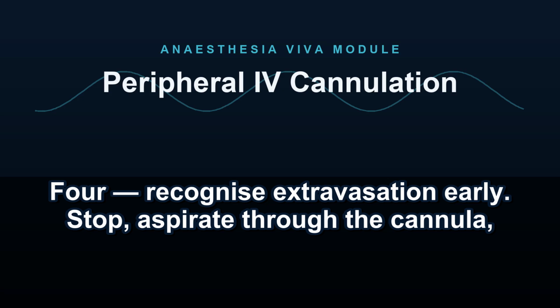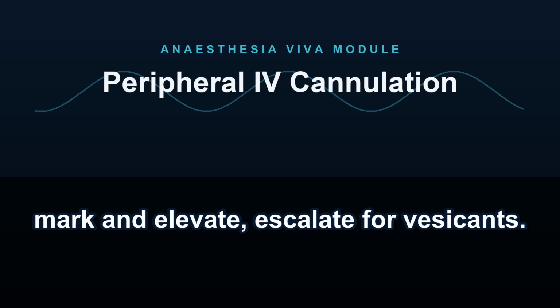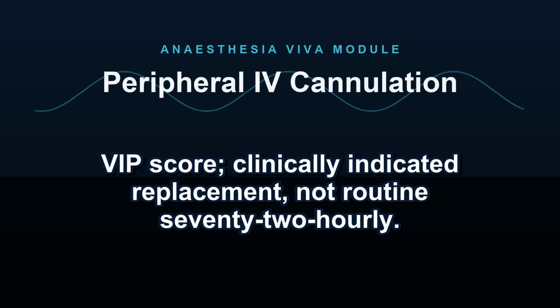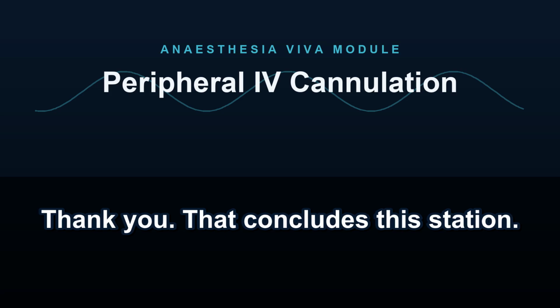4. Recognize extravasation early. Stop, aspirate through the cannula, mark and elevate, escalate for vesicants. 5. Review daily and remove when not needed. VIP score, clinically indicated replacement, not routine 72 hourly. Thank you, that concludes this station.